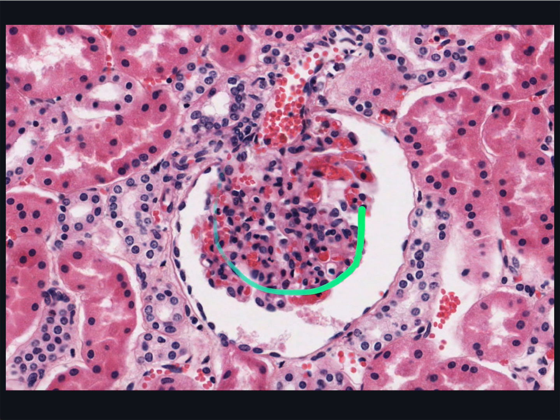However, really, it would be impossible to tell whether this is an afferent or an efferent arteriole. But I think you get the message. But I'm sure this little aggregation of nuclei next to this blood vessel may be a macula densa. So perhaps this is an afferent arteriole. But we refer to this region of the glomerulus as a vascular pole.